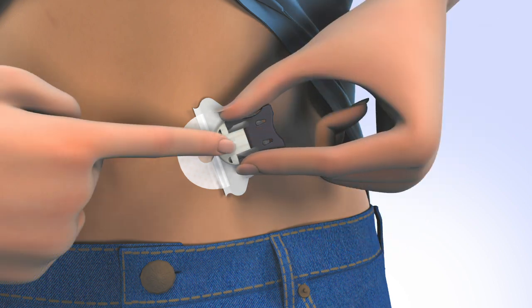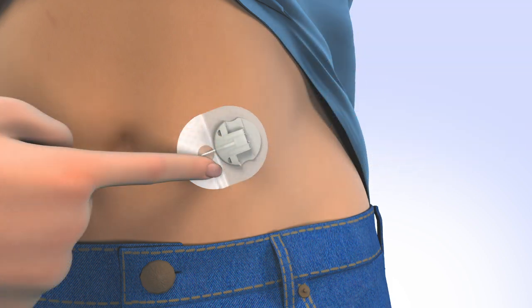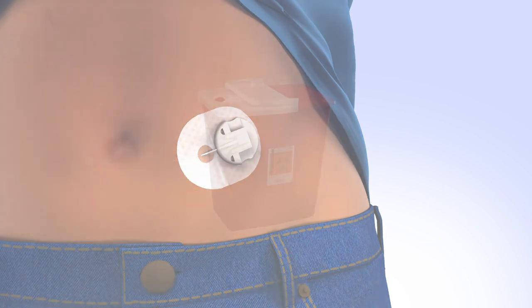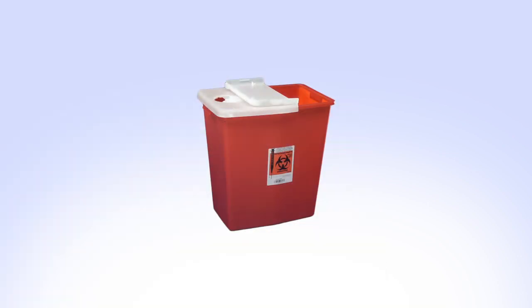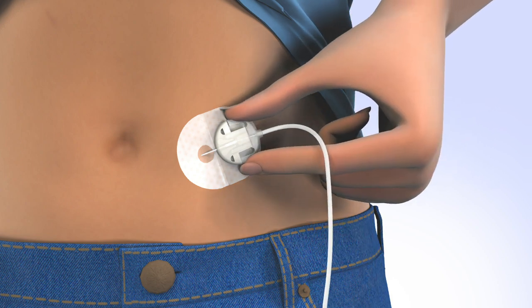With the other hand, squeeze the gray arms and pull back to remove the introducer needle. While keeping the set secure, gently remove the remaining paper and smooth to skin. Dispose of the introducer needle into a sharps container. Now connect the infusion set tubing to the cannula housing by sliding the connector directly into the cannula housing until you hear an audible click.